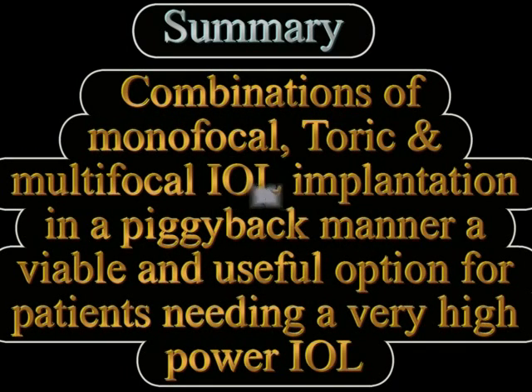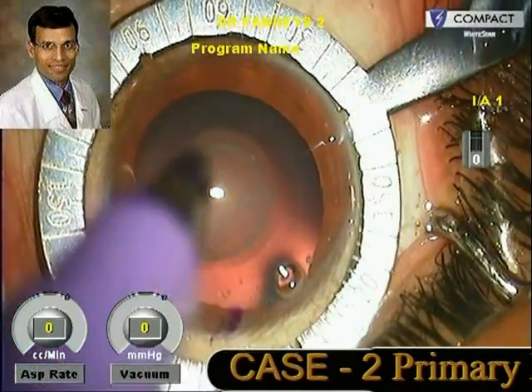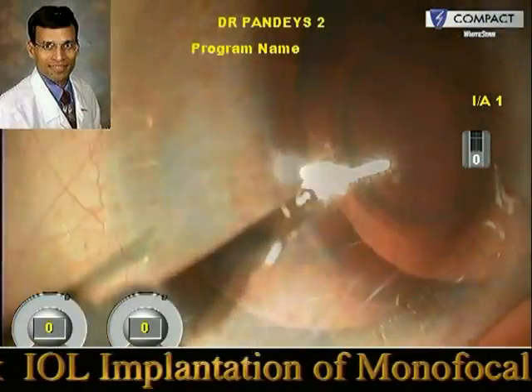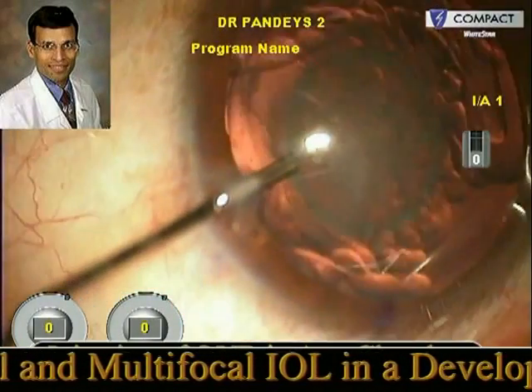To summarize, primary piggyback IOL implantation can be done not only to achieve a high IOL power in cases of high hyperopia, but different combinations of monofocal, toric, and multifocal IOL implantations can also be done in a piggyback manner — a viable and useful option for patients who need a very high power IOL and want good refractive results as well as spectacle independence. This is the second case where a primary piggyback IOL implantation has been done for a developmental cataract using a combination of a monofocal and multifocal IOL.